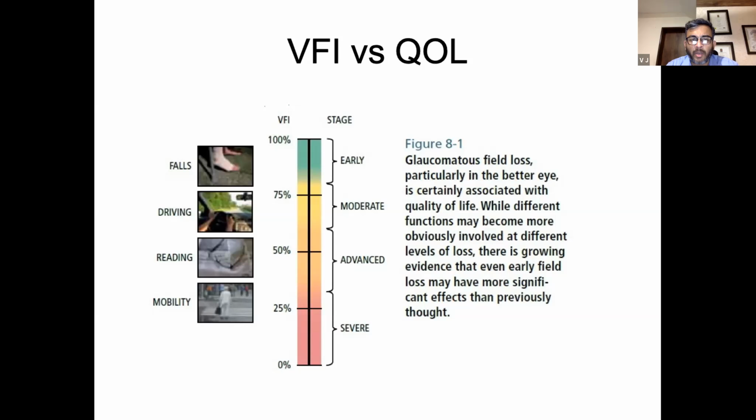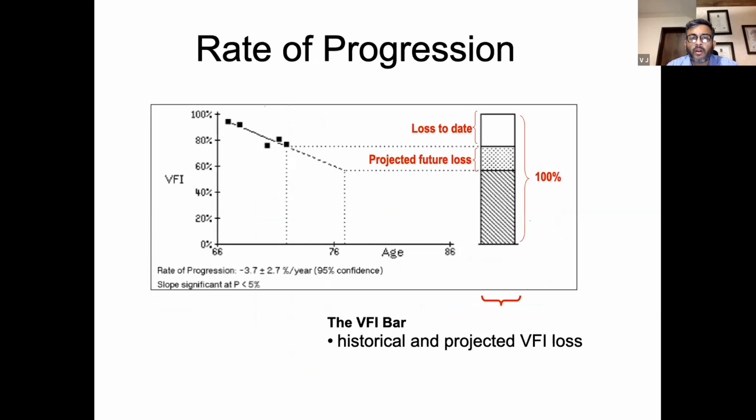When it falls below 30, you should try not to let your patient progress beyond that. Therefore, always try to get this printout in your visual field so that you know where you stand, how fast the patient is progressing.